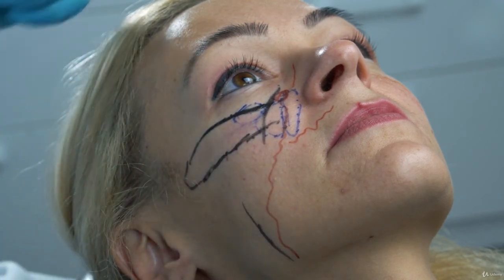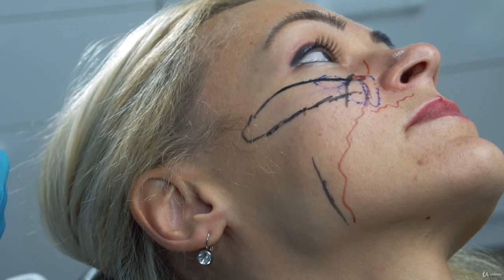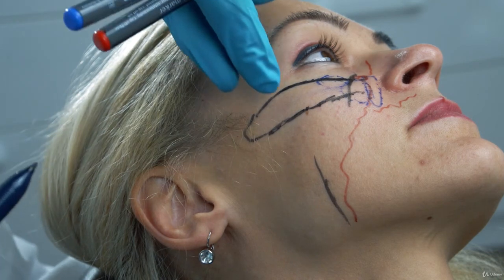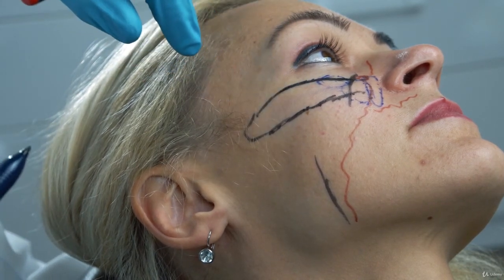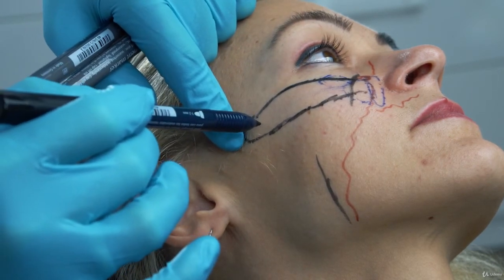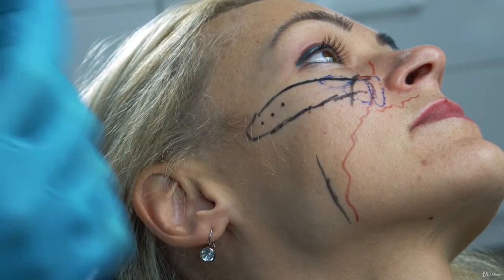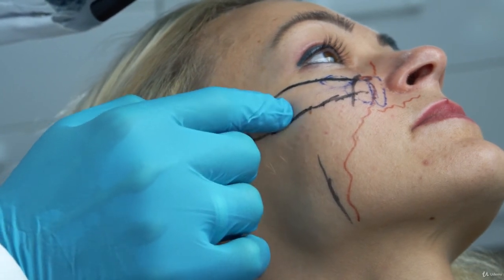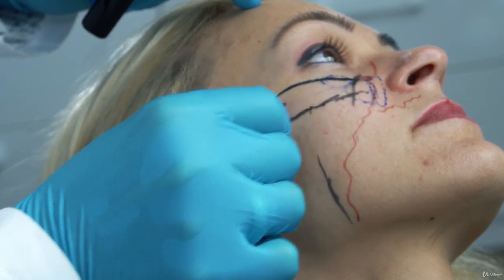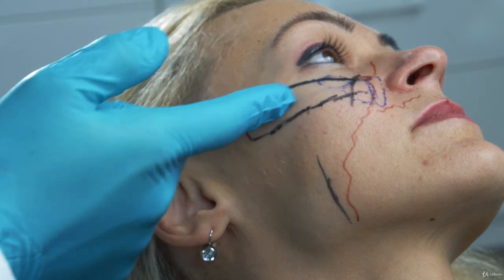little more. Now, there is a very good course made by Dr. Mauricio de Maio, the MD Codes. Along the logic of MD Codes, we should try to elevate facial structures as well. So I'll be injecting not only into the prezygomatic space, but taking MD Code area Cheek 1 to inject on the lateral part of the zygoma bone. These injections will create some contour. If we want to create even more contour, we need to enlarge dosage.